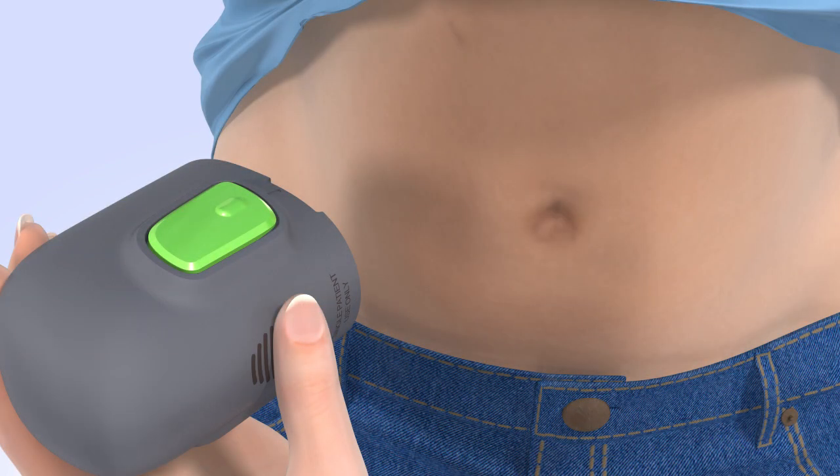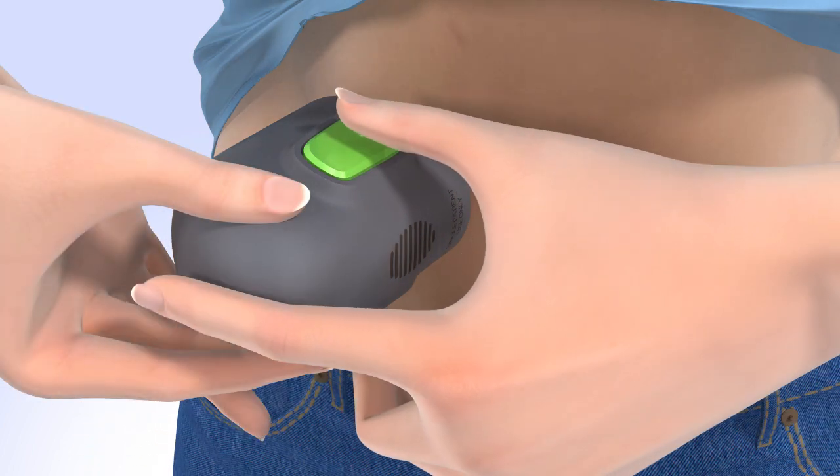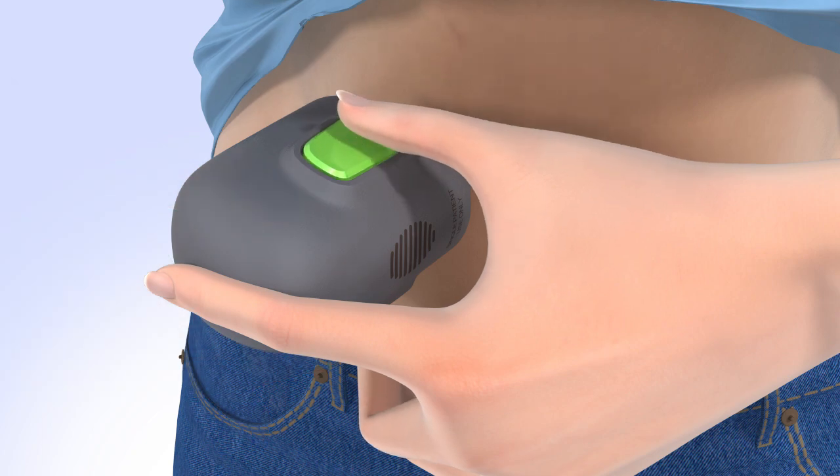Place the base of the serter flat against the site that you prepared. To insert the sensor, be sure you are holding the serter securely against your skin without pushing it in too deeply. Press and release the small bump on both green buttons at the same time to automatically insert the sensor. It is important you hold the serter securely against your body while you do this step, as the serter may spring back after pressing the buttons, resulting in improper insertion of the sensor.